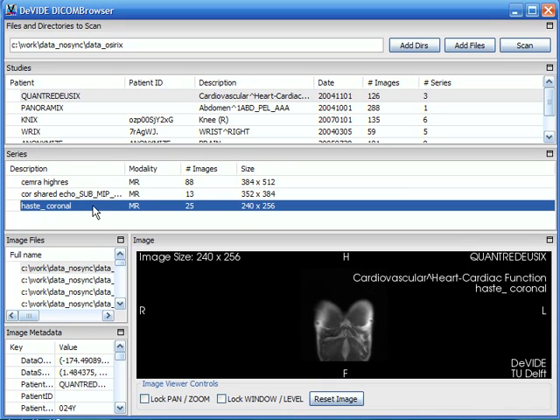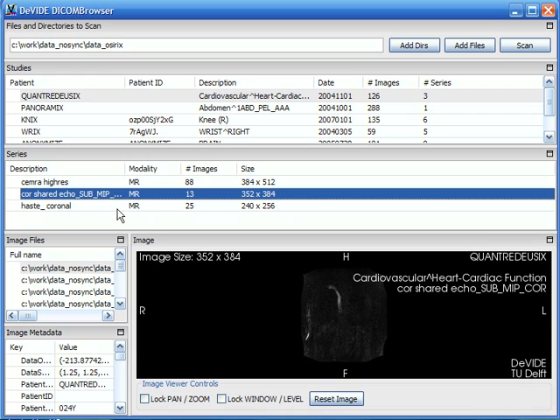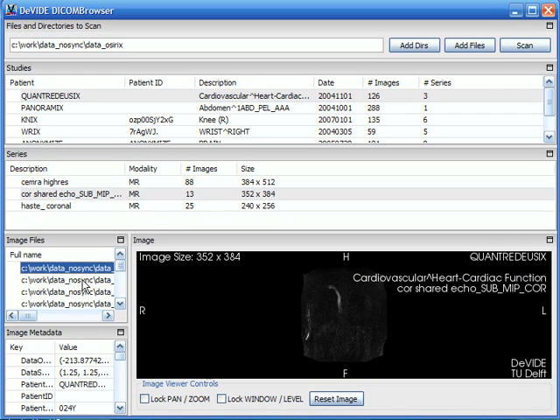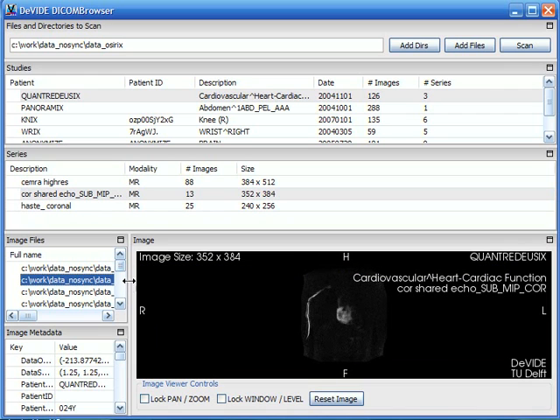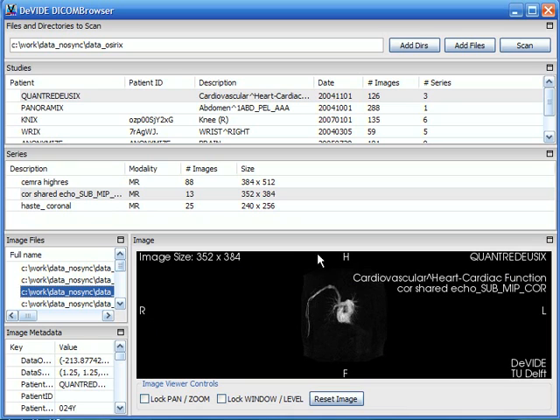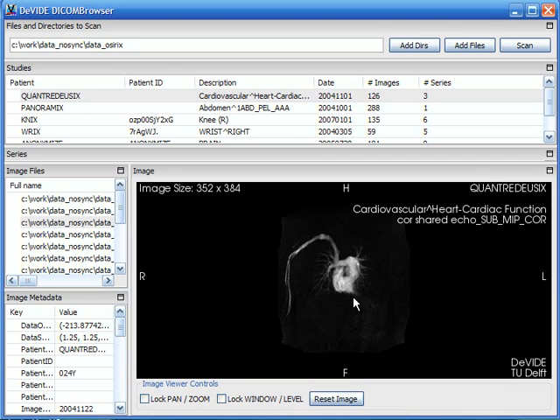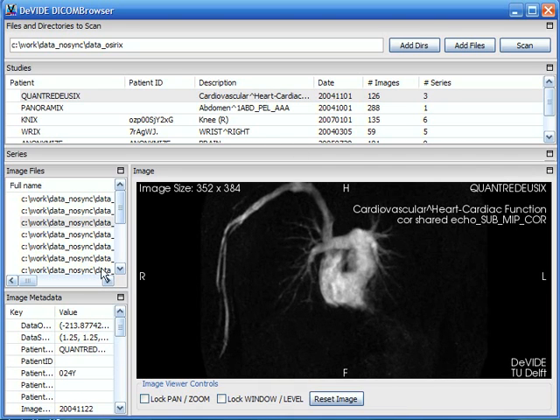And once again in the same way I can go through the series and for each series I then see the file names that belong to that series and if you select a file name it gets updated in this viewer window over here.